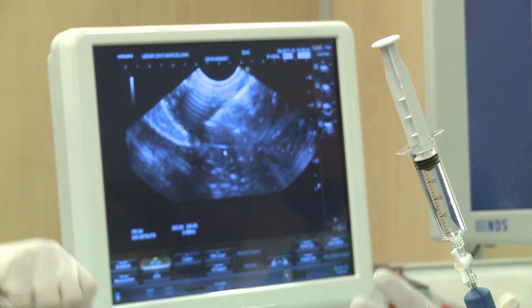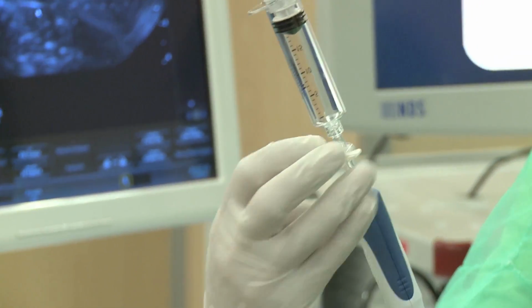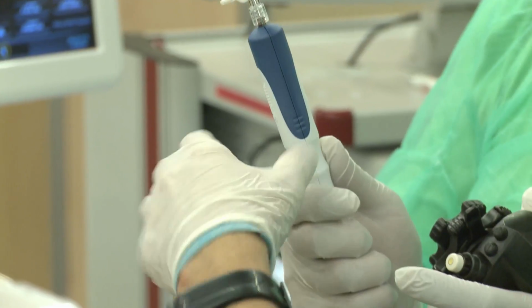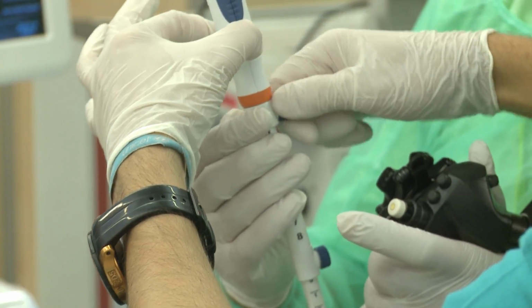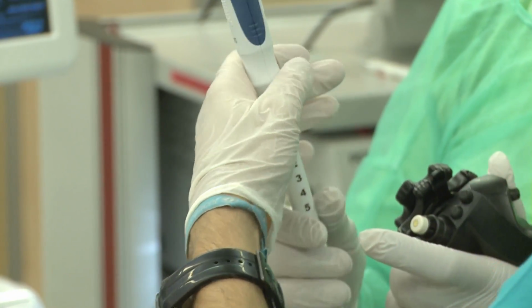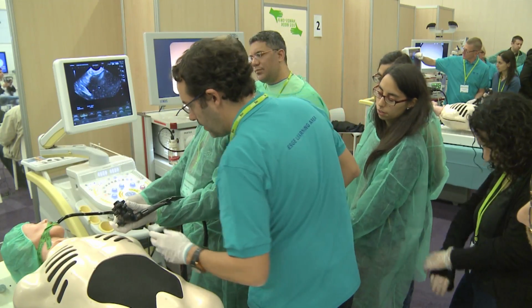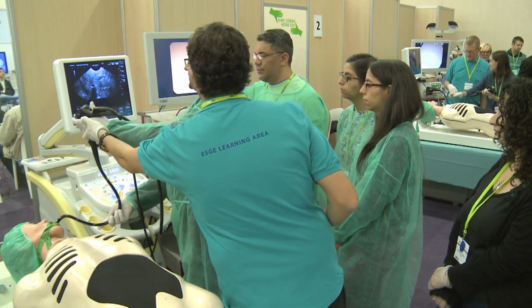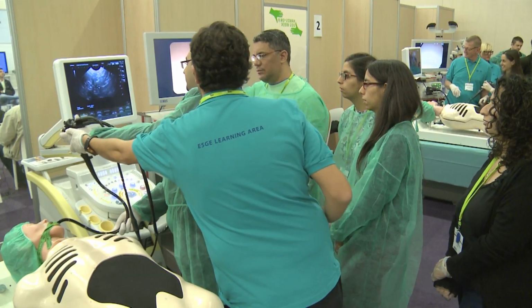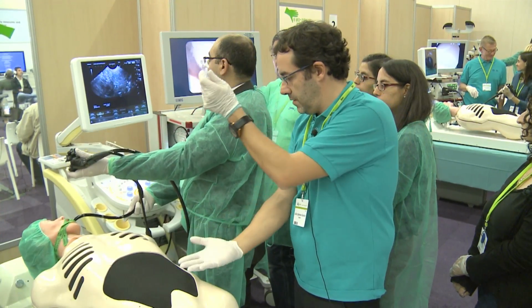Now, when we finish, first, stop suction. Second step, remove the stylet, the needle. This part, up. Okay. Now, we put this up. And second, finito. And instead of moving so much, if you use this hand like this, it's even better. So the idea is just to move. If you move it completely, it's easy.